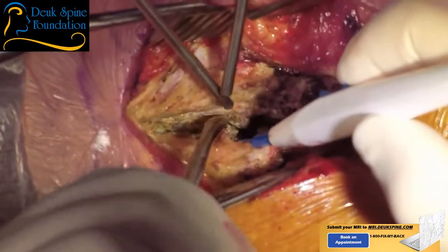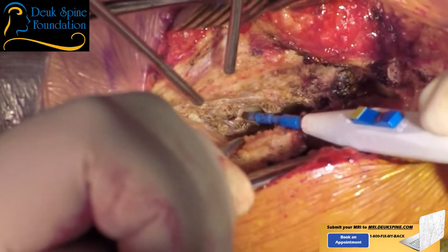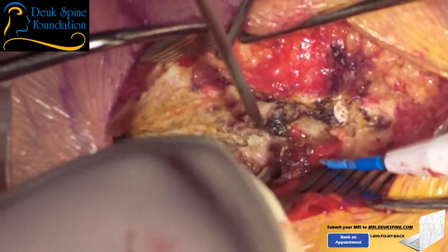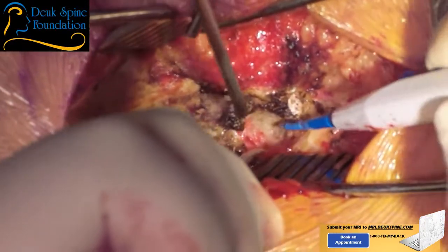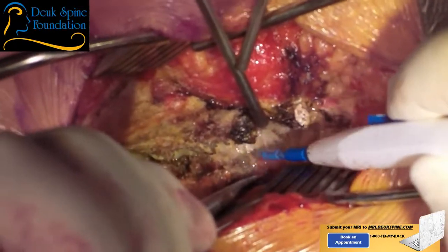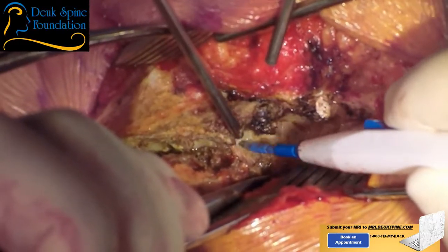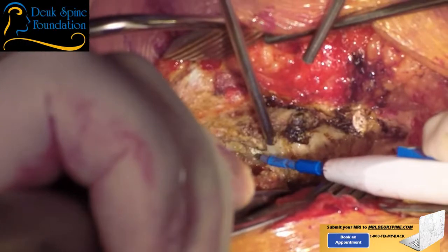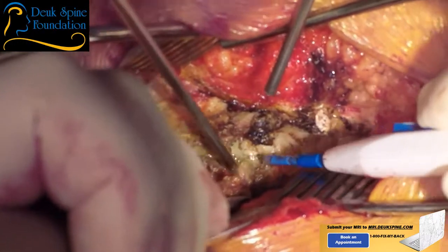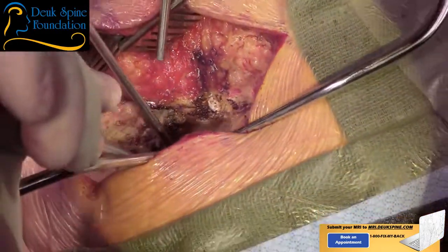Can you see through my view up there, Dr. Atwater? Yeah. You see that right there, that white with the blood vessels on it? That's dura. So you can see how easy it is to make a mistake and get between those lamina. You just have to be super careful. Key is to stay on the bone.